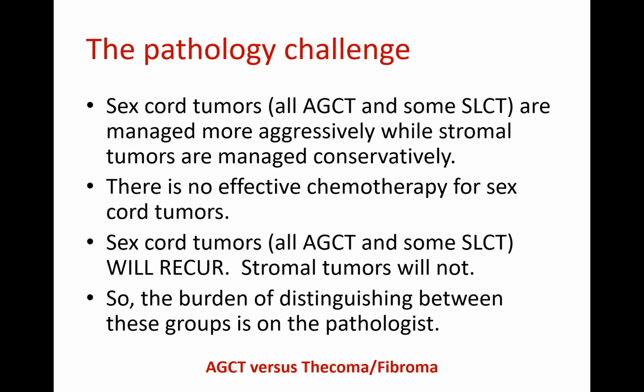fibroma. Unfortunately, when we give these presentations, when we give lectures, we always, as you expect of me today, present you with classic examples. So you are sitting, listening to me now, and say, how can I mix granulosa cell tumor with thecoma? These are two different tumors. You showed me they are morphologically very different. Yes, but I showed you the very classic examples, or I will show you classic examples. But just remember, in your head, differentiating sex cord from stromal tumor, as I said, that's one highway in my thinking, could be really, really very challenging. We will try to give you some tips today.